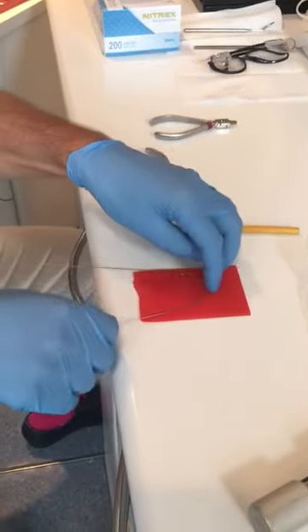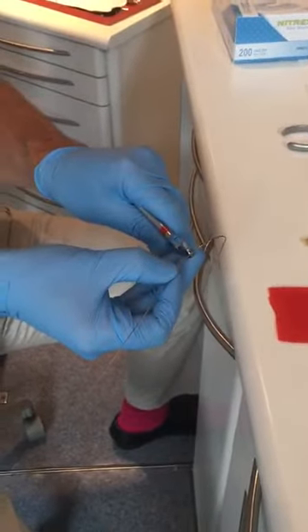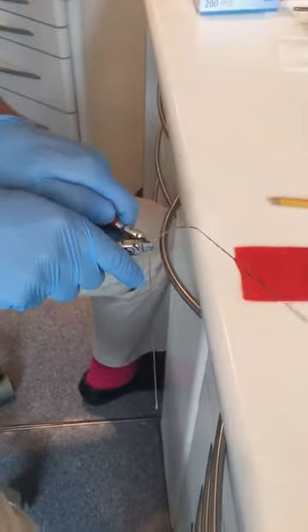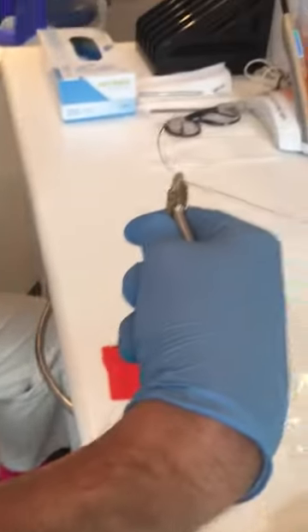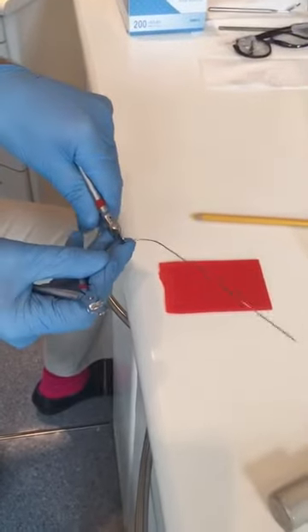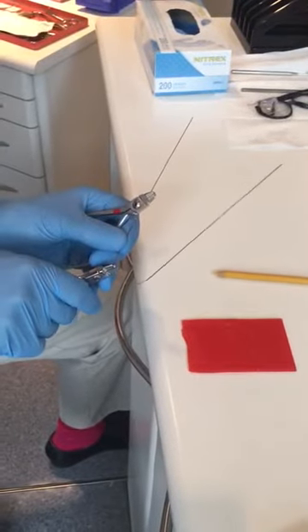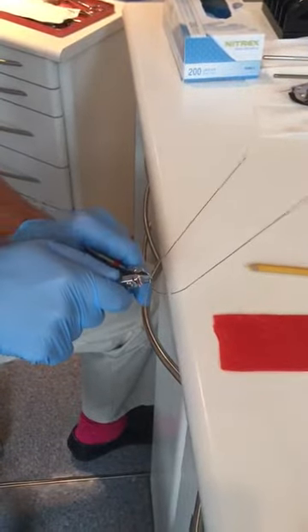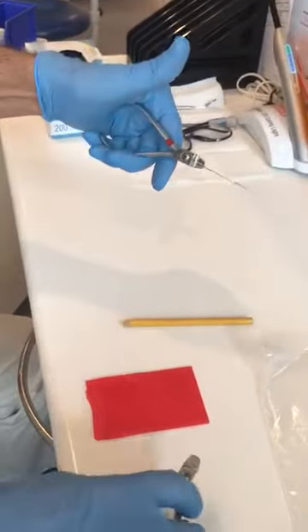And what I'm going to do now is I'm going to use the torquing pliers just to take out the torque distal to the lateral incisors. So I'm just going to flatten it out there slightly. So if you look there, it's almost straight. You look here, compared to the torque you have in the anterior segment. I'm going to do the same on the other side. So I just grip it with the torquing pliers and just bend it, flatten it out a little bit, just to get that more horizontal, like that.